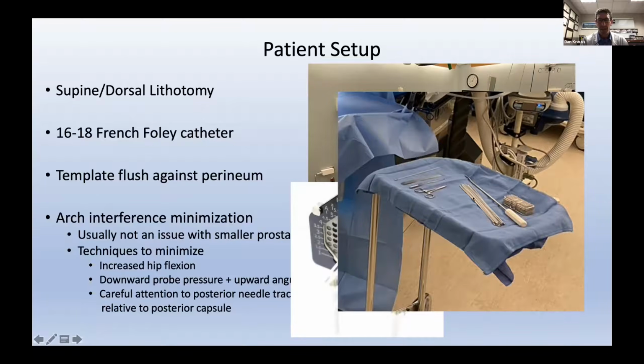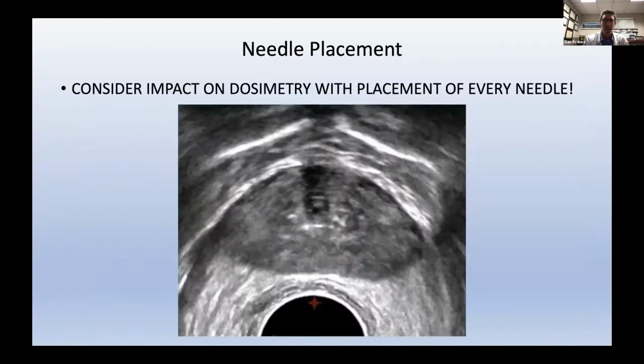Our needles are here. We keep one mosquito clamp, which you need if you ever, for whatever reason, want to remove a collet from the template. You can't see it too well here, but we'll keep a hook to help deflect needles for optimal positioning, a ruler, and if the patient's skin is thick, sometimes you'll want to break the skin with a sharp metal needle.